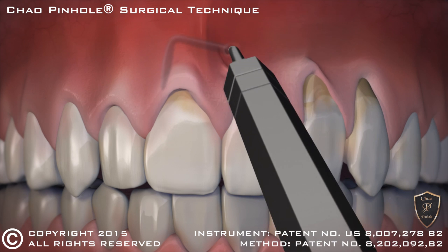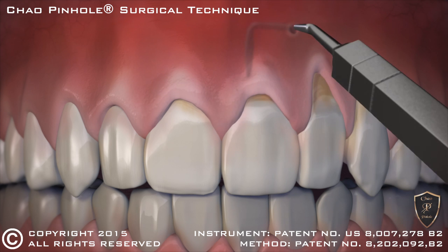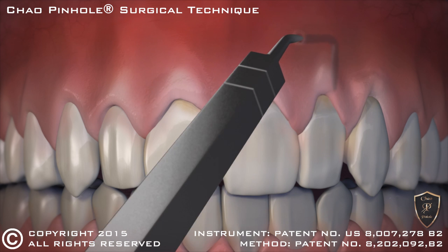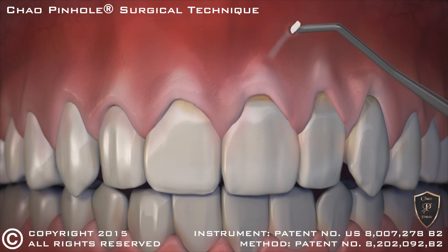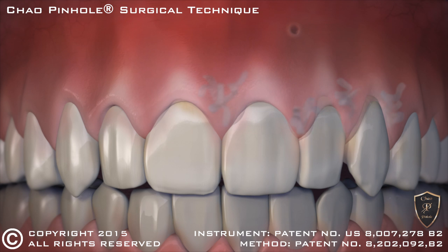Once free, the gums are guided down into a healthy position. When the recessed gums are corrected, tiny collagen strips are placed inside to help stabilize the gums. Incredibly, the pinhole heals rather quickly and often overnight.